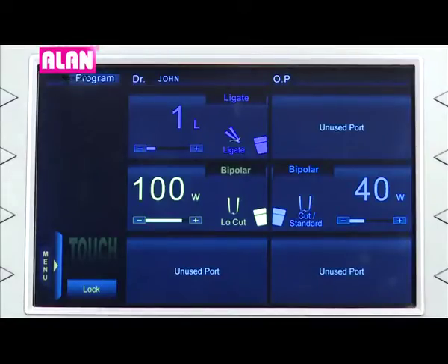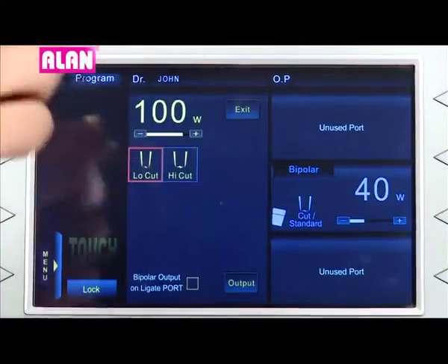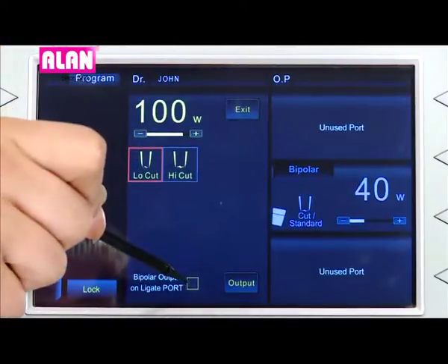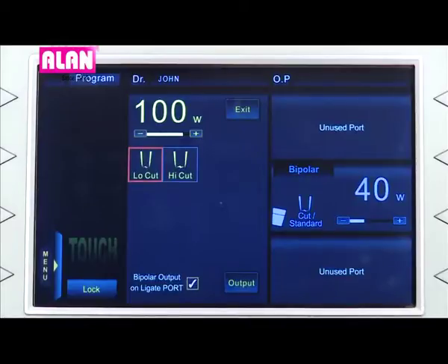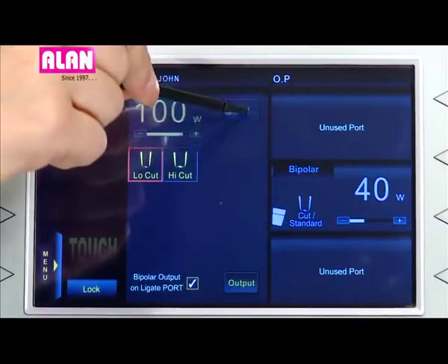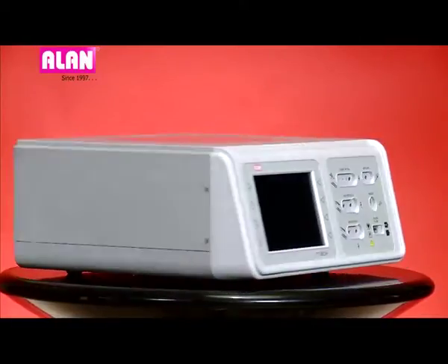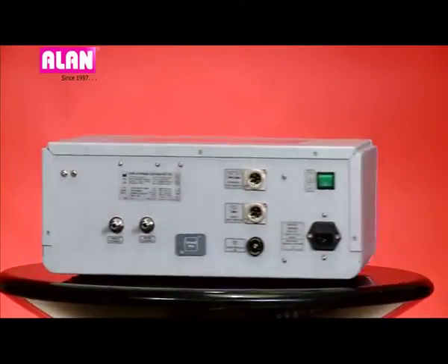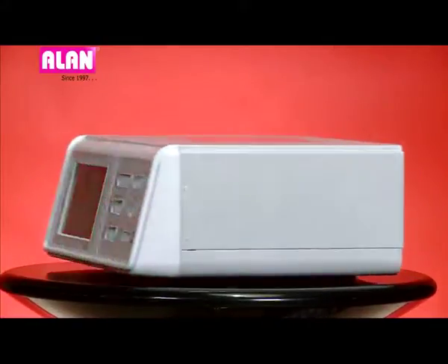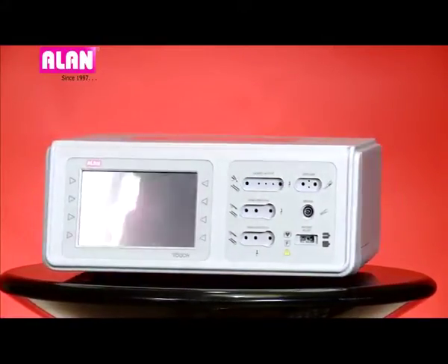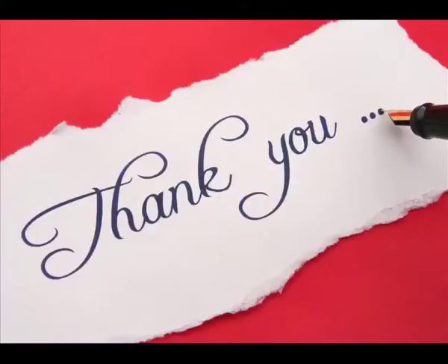To enable this feature, touch the bipolar mode icon and select the option 'bipolar output on ligate port.' In the same way, it can be disabled too by touching the bipolar output icon.